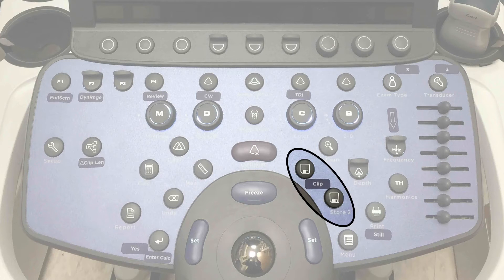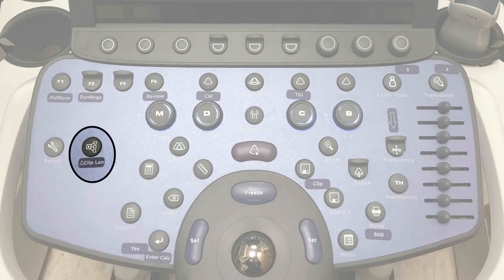Unlike previous Sonosite systems, if you press clip again while a clip is being captured, it will truncate that initial clip so it will be shorter than six seconds and will then capture a new clip — you will not lose the information. If you need to adjust the clip length, click on the protocol button highlighted by the change clip length sticker and adjust accordingly.